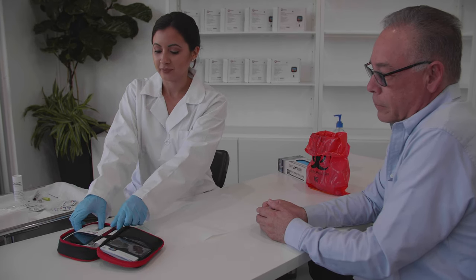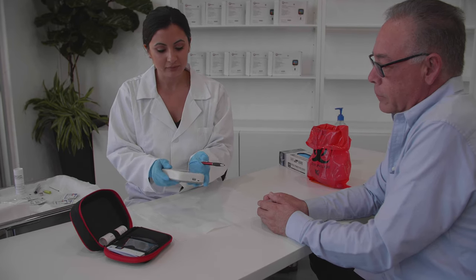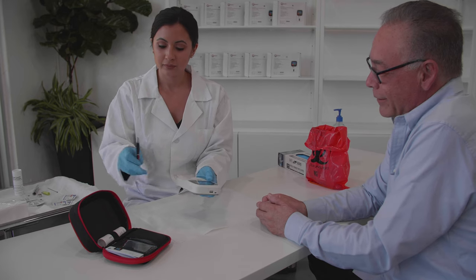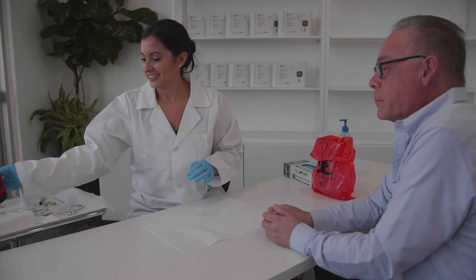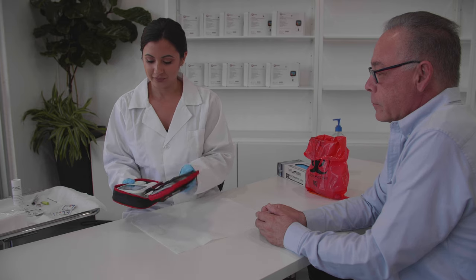The CoagSense system consists of a meter and single-use PT strips and control strips along with certain accessories required for testing. Controls should be tested with each new lot of test strips when they are received. Consult the user manual for instructions on running controls. This video will cover the basics of using the CoagSense PT-INR monitoring system. For complete instructions, be sure to read the printed user manual and all packaging inserts.